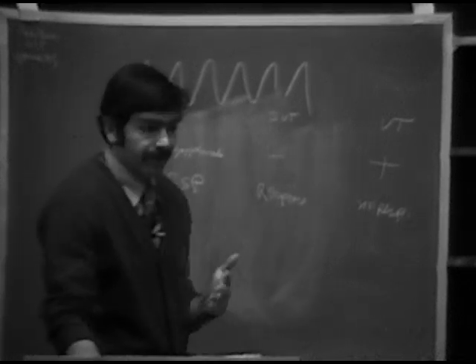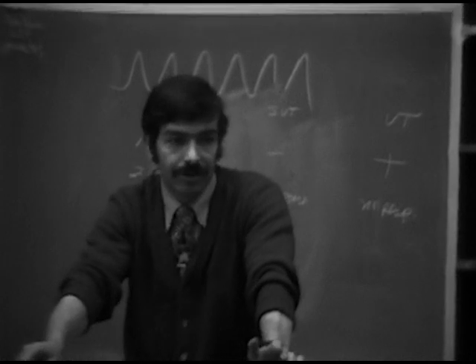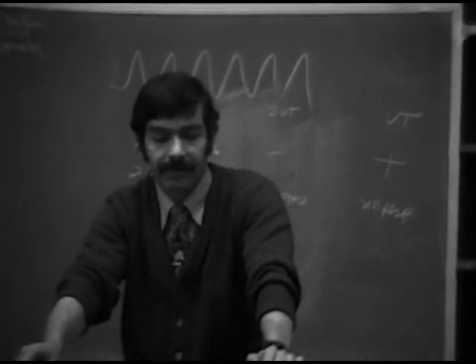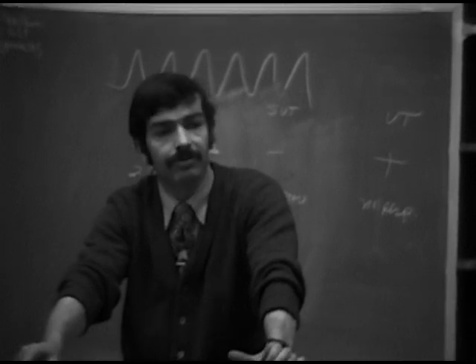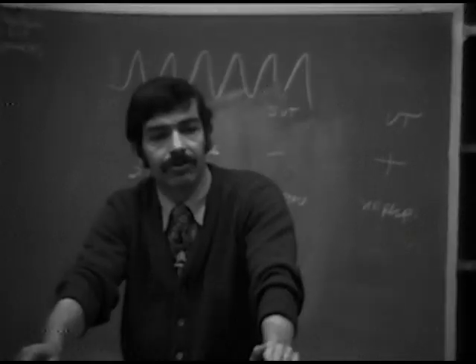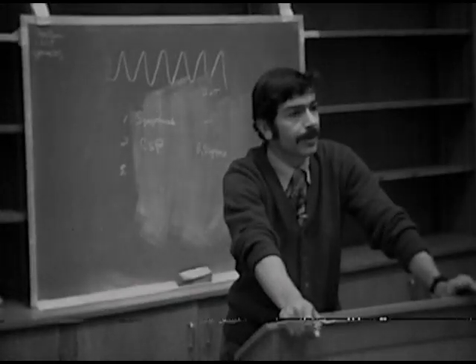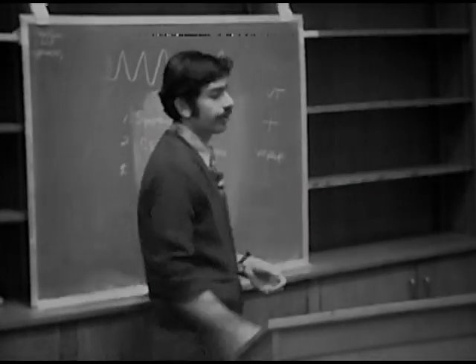Now, generally the best leads, as we said, are leads 2 and V1. They're generally the most satisfactory leads. If this doesn't work, then we can try looking at some other things like Lewis leads, as we mentioned, CF leads, if we can do that on the particular electrocardiogram. And then finally, we can go to such things as esophageal leads and eventually an atrial wire in order to see the relationship of the P waves to the QRS.